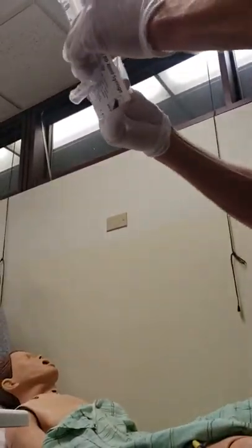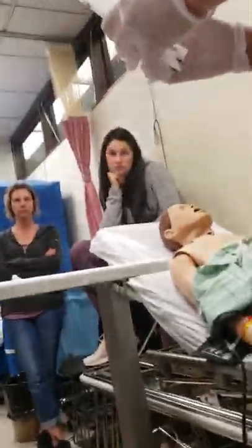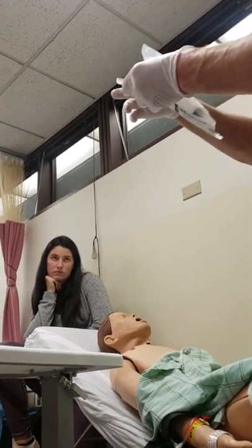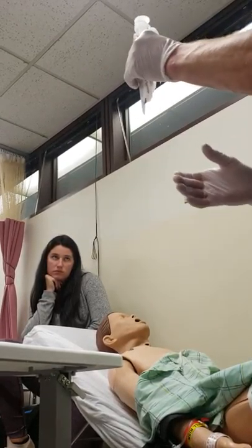Everything is meant to be opened a certain way. When I open up any syringe, I pull it back like a banana. A lot of nurses do it differently and then pull it out — but it just touched where they touched. So when I open up a syringe, I hold it back like a banana.